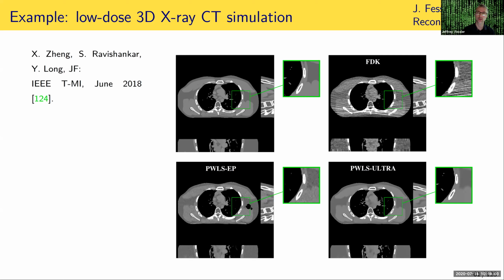This is what's been in X-ray CT systems in the clinic since about 2012. It's called model-based image reconstruction, and those methods use edge-preserving regularization. So you can see that it greatly reduces these streaks. All right, but you notice there's some fine details in the lung, I hope you can see this over Zoom, fine details that are still not fully captured in this edge-preserving reconstruction.